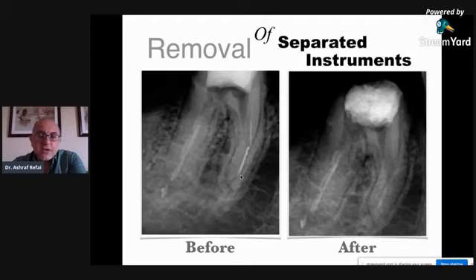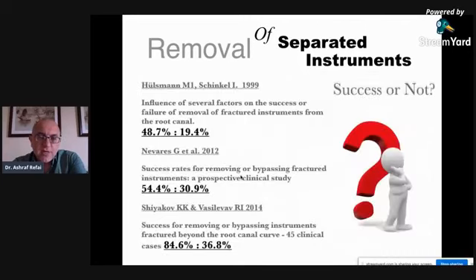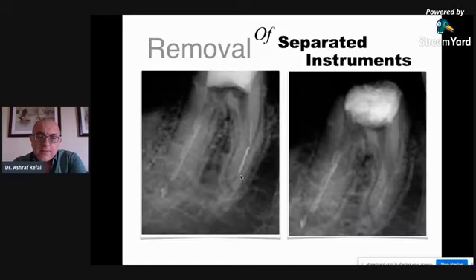In this case, I removed this with a tube system. And I just wanted to show, just out of curiosity, if you can see here, this is the preoperative. This looks like the outline of a tapered stone, a tapered diamond stone with a flat end. And before this general dentist referred this case to me, it seems he inserted a diamond stone into the canal to try and retrieve this instrument.